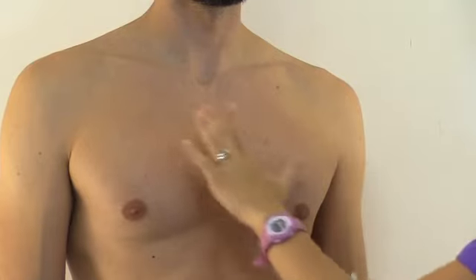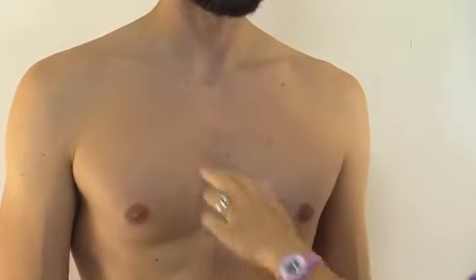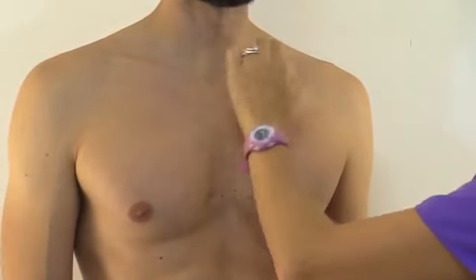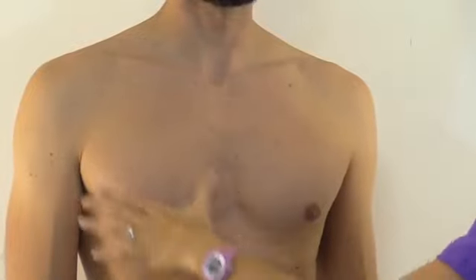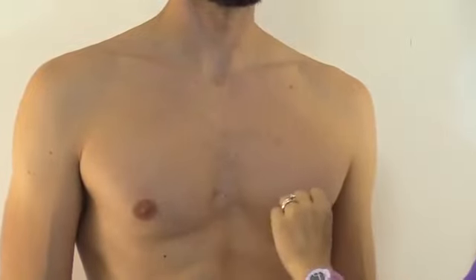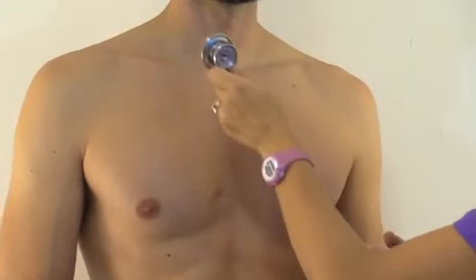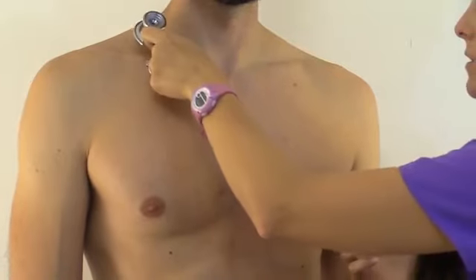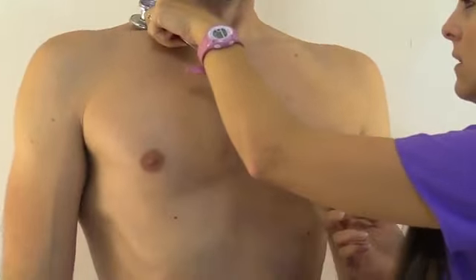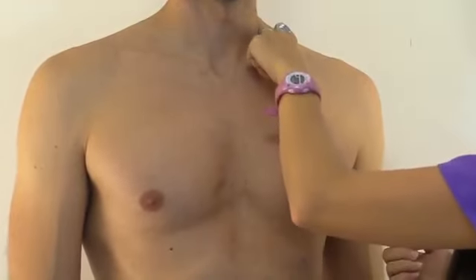First, we're going to listen anteriorly with the diaphragm of our stethoscope. We're going to start at the apex of the lungs, always compare sides, and inch our way downward, assessing all the lobes of the right and left lung. So first, let's start up here. Ben, I want you to take a good deep breath in and out. So here we go, apex. Okay, we're going to compare sides.